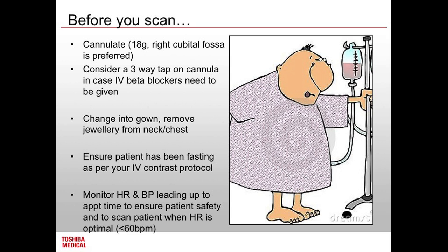So I'm a fan of oral beta blockers, and there's heaps of different protocols you can use, and we can't really tell you what to use on that. You'll have to come up with your own policies. However, if you know Steve Lane, I'd be calling him because he'd have access to some pretty good IV beta blocking protocols from the Amboy General that a guy called Craig Maskeel has come up with. He trained at Prince Charles. He's really good at cardiac stuff. So he's got pretty much like a chart. It says kilograms, heart rate, how much metoprolol to give. All this stuff we already know.